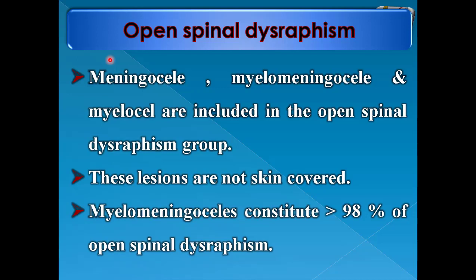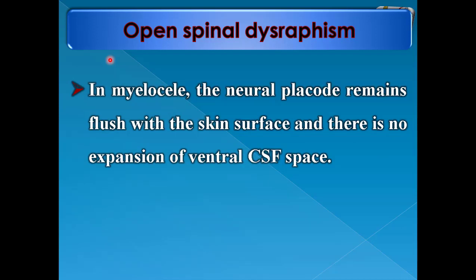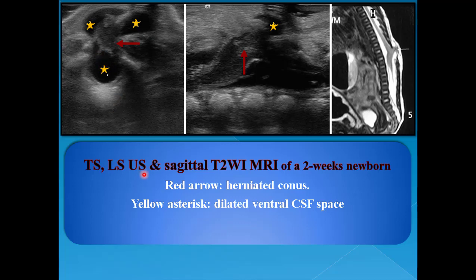Open spinal dysraphism: myelomeningocele, myelocele, and meningocele are included in the open spinal dysraphism group. These lesions are not skin covered. Myelomeningocele constitutes more than 98 percent of open spinal dysraphism cases. In myelomeningocele, an expansion of the ventral subarachnoid space displaces the neural placode dorsally, resulting in portions of spinal cord, nerve roots, and leptomeninges lying within the sac. In myelocele, the neural placode remains flush with the skin surface and there is no expansion of the ventral CSF space. On TS and LS ultrasound and sagittal T2 MRI of a two-week newborn, the red arrow denotes the herniated conus medullaris and the yellow asterisk denotes the dilated ventral CSF space.